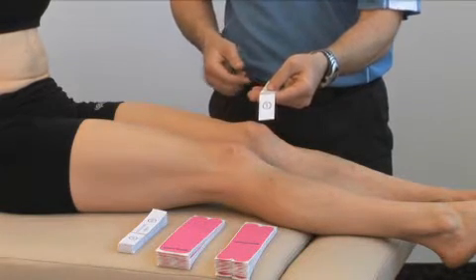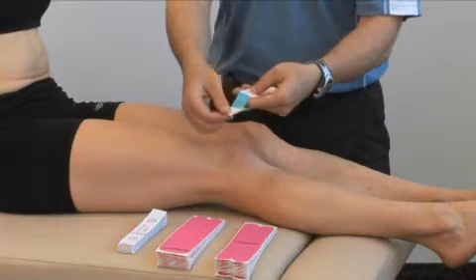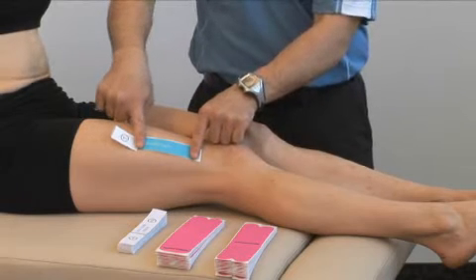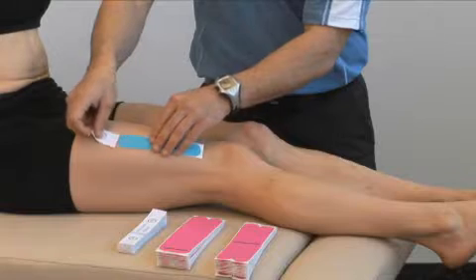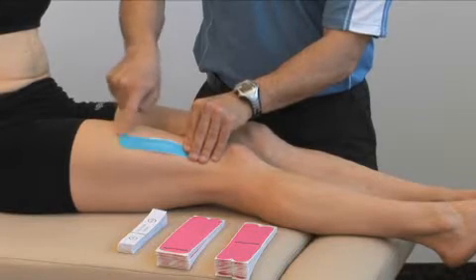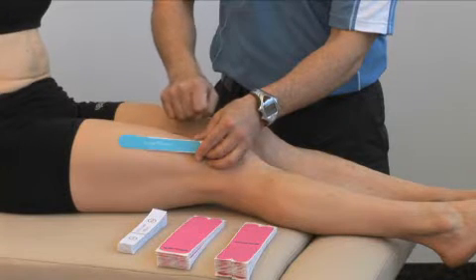From there, localize where you want to apply the tape. Apply section one by gently peeling the backing away from the tape — not the tape away from the backing — and laying the tape over top of where you want to apply. Gently peel the backing all the way off, letting the tape come in contact with the skin, and then rub over top to activate the glue. The adhesive is heat activated, so rubbing over top of each section as you apply it is important.